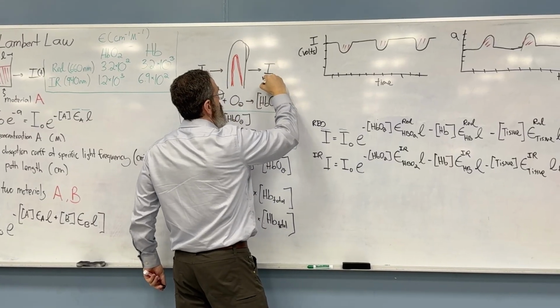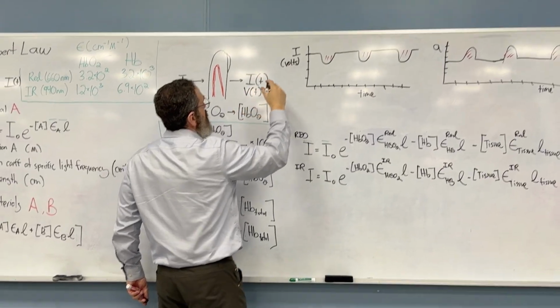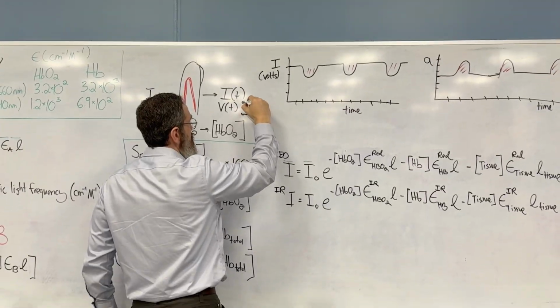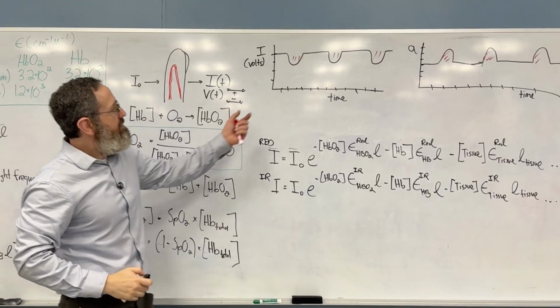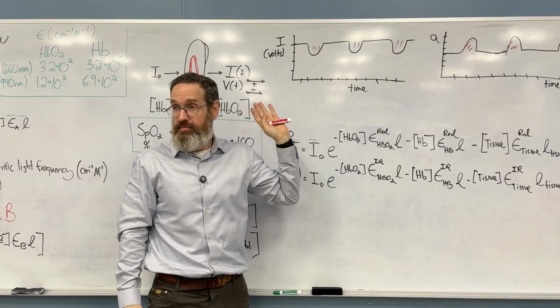So we have a voltage here. These are a function of time. So this is intensity, and this is associated with the voltage. And this voltage is sitting on a potential. What I want to do is extract the part that's changing and be left only with this blip.